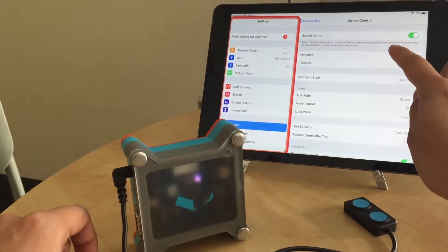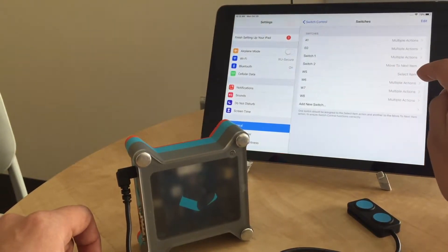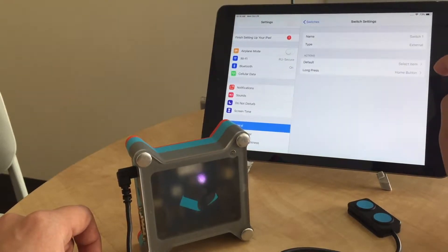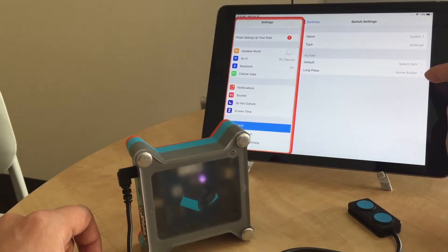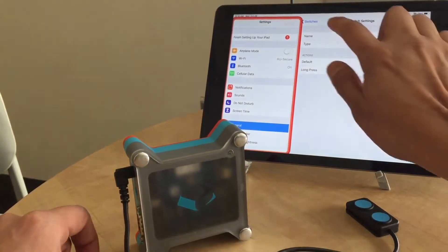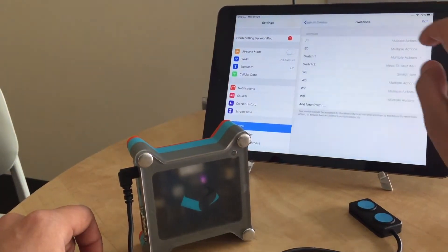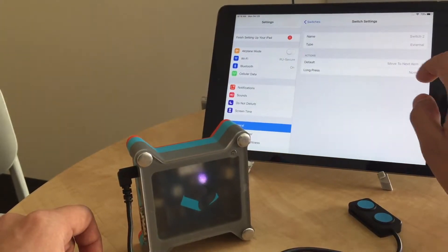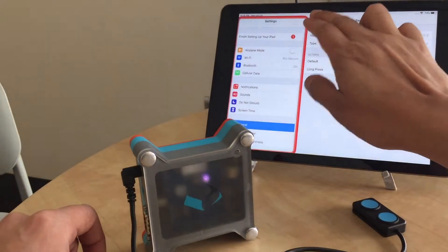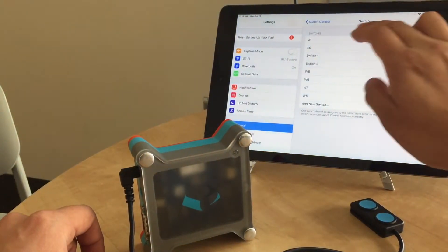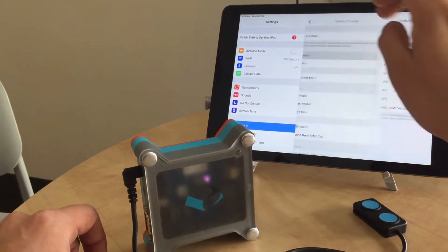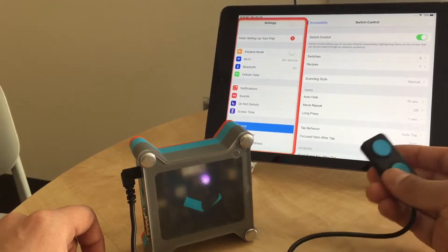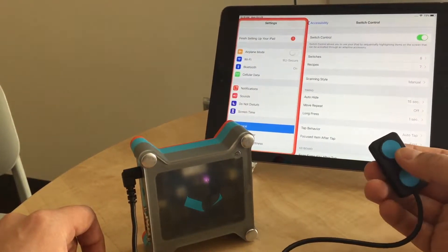As we can see here in the configuration, switch one you can set to select item and home button, and switch number two is move to next item. So I should be able to press and hold the top button to go home.